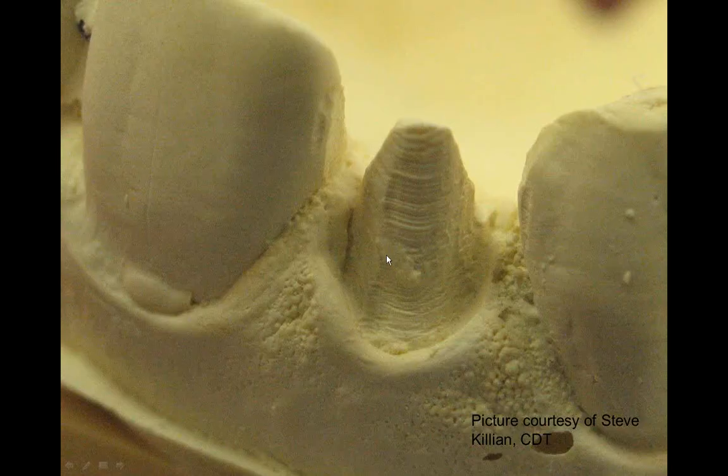Okay, let's see what it looks like when it comes out. Here it is. Okay, once again, one of those globs. Now, a lot of us would just launch in and scrape that off, and that's fine. But what concerns me more is this ridge that's running right through here. I don't know too many dentists that when they prep a surface out here will lift up their burr and then go back at it again and leave that nice ridge. So what that ridge is really indicating is that we've got some kind of distortion in the impression. This we can fix, but where's the distortion? Where is the difference?